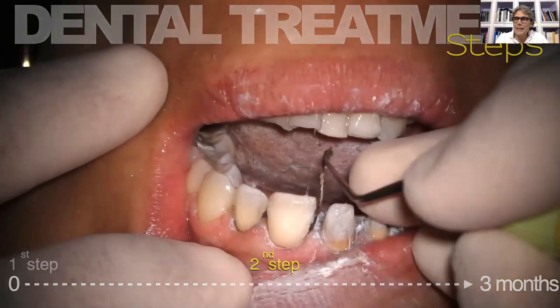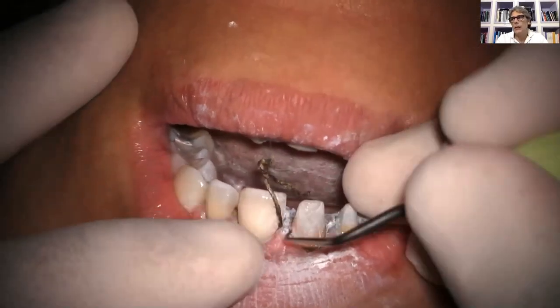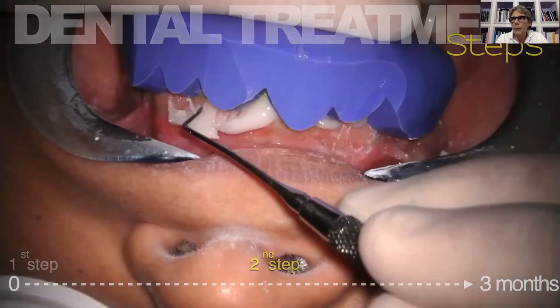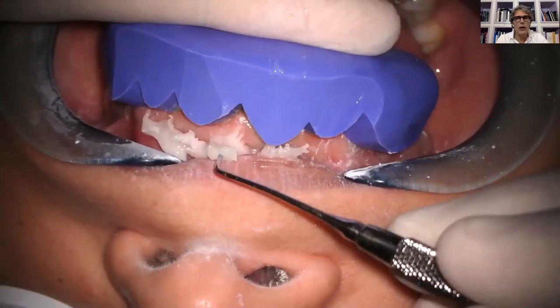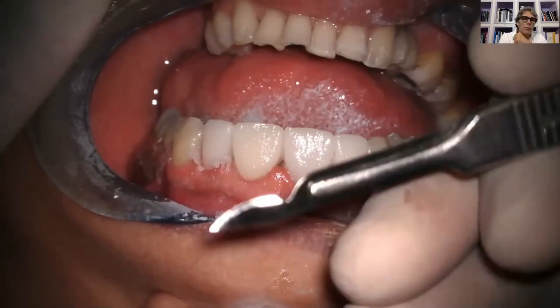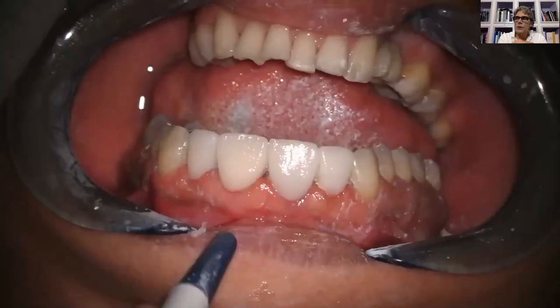So in a case like this, in which I'm not able to finalize the case by cementing the restoration directly, after removing the retraction cord and after cleaning all the powder that, like in this case, I used, I always use the mock-up as a temporary using the silicone index, as you can see from this video I created. Like in this case, for the temporaries, I remove by scalpel blades and by the diamond bur the excess of resin, and I send the patient home.